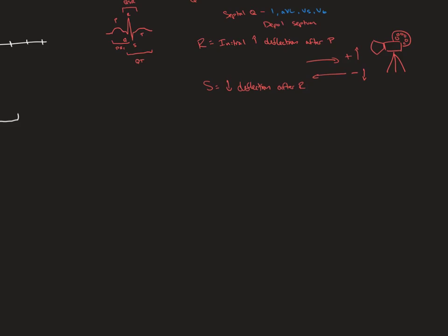I guess we can go over QRS duration. This is still kind of 12 lead because, again, rhythm leads aren't scaled. The QRS should be less than or equal to 120 milliseconds, typically, if you're looking for pathology. Otherwise, you start looking for blocks.